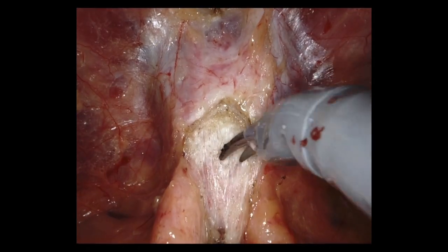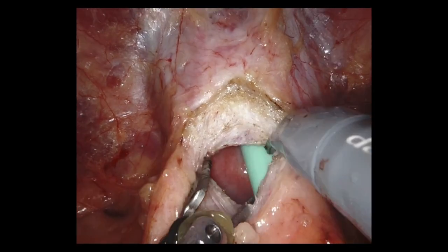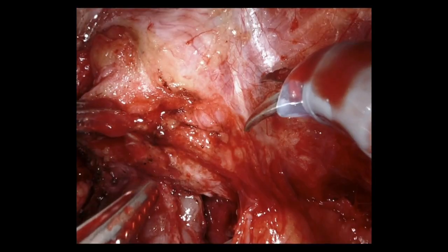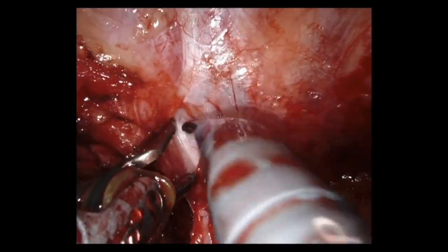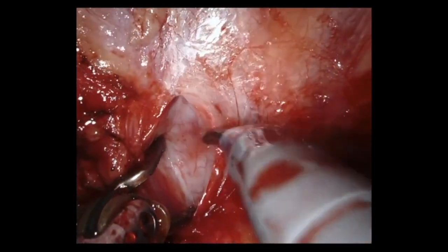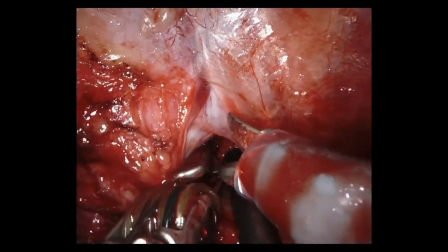In this technique, we do not use the suspension stitch. In the current technique, the endopelvic fascia dissection is performed after the posterior prostate dissection, and the lateral prostatic fascia is preserved.